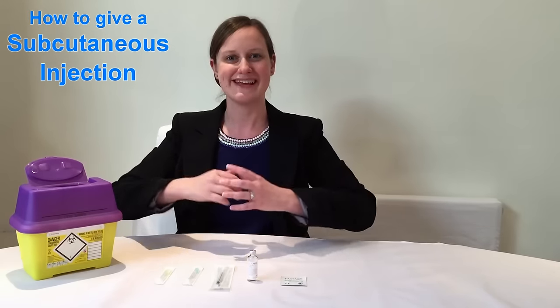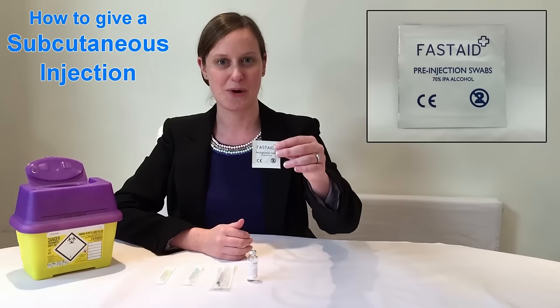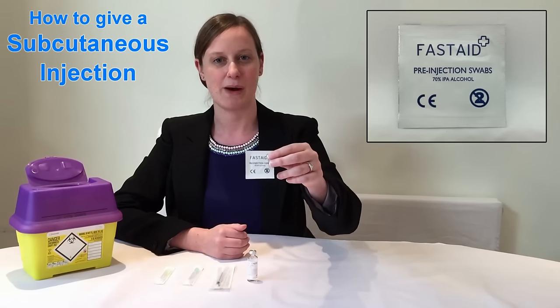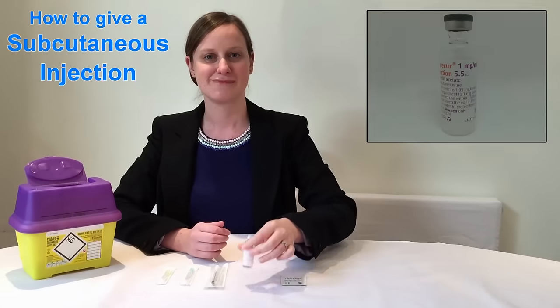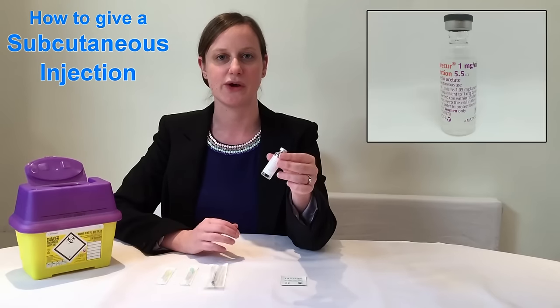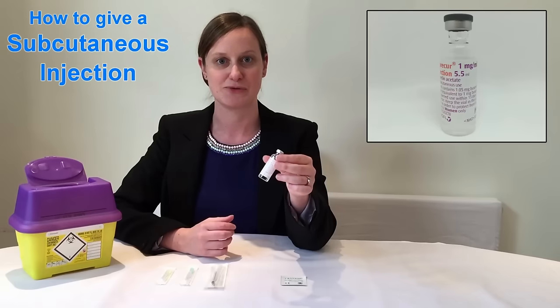The first thing you need to do is get everything ready that you're going to be using. You can see that I've got it all assembled here in front of me. We've got the alcohol swab. This is used to clean the top of a reusable medication bottle and it's used to clean the site where we're going to give the injection. This is the medication bottle. It's reusable and so we're not going to be using all of the fluid that's inside it, but we're going to be drawing up a set amount from it.